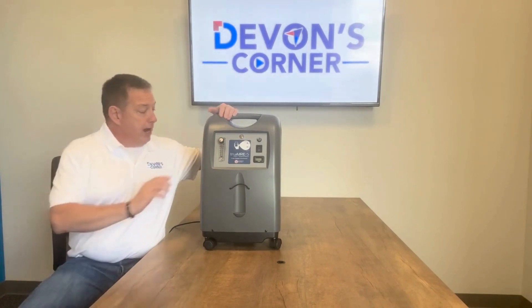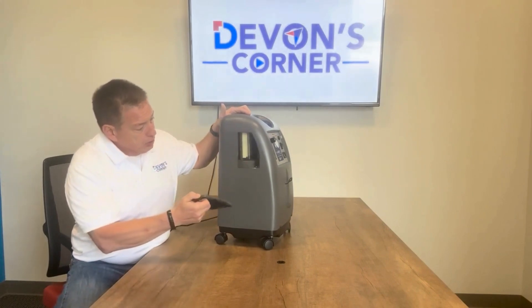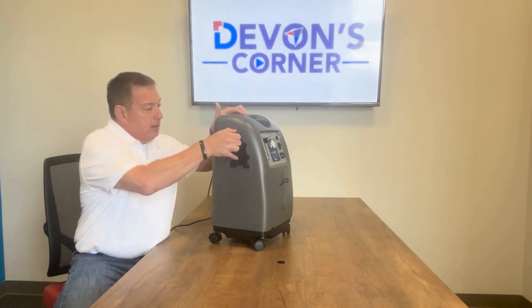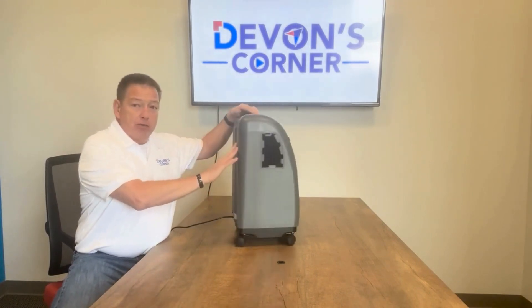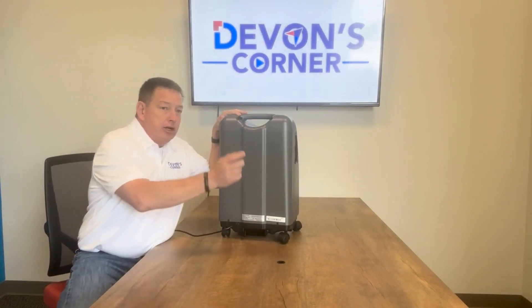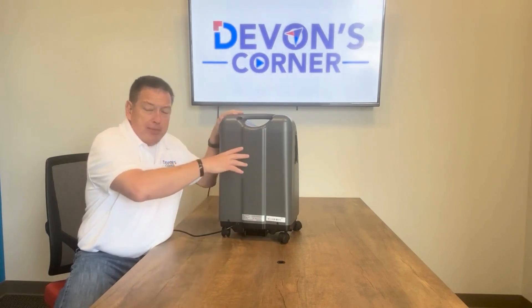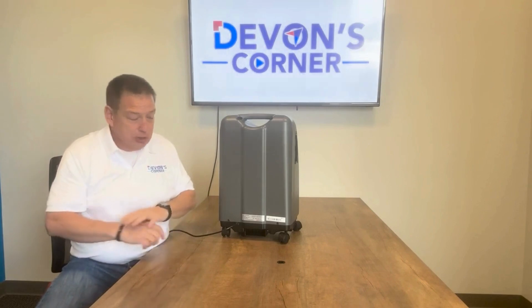On a TrueAir 5, not only do you have the quick release filter and quick access to your intake filter, but when you remove the cabinet, your sieve beds are conveniently located, along with the control valve, pressure equalization valve, and compressor rebuild — everything is very easy to access and quick to get to.